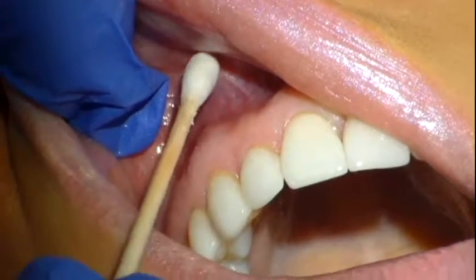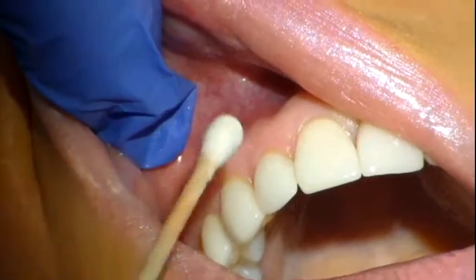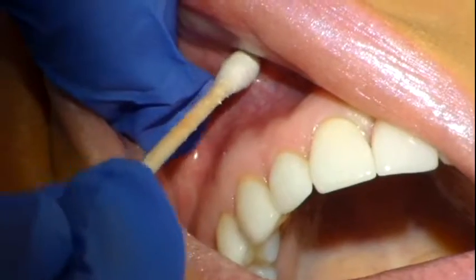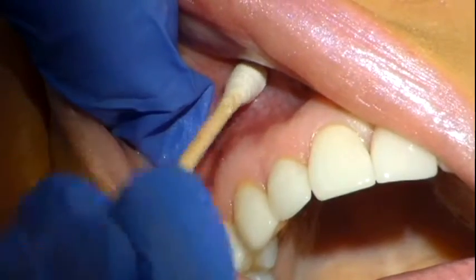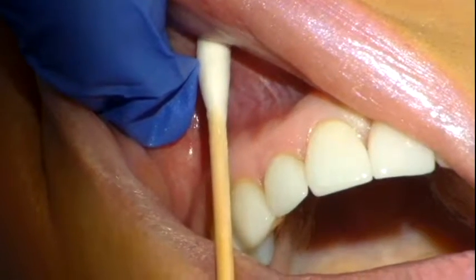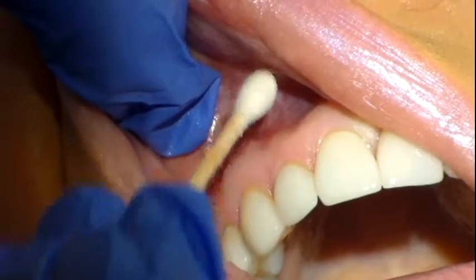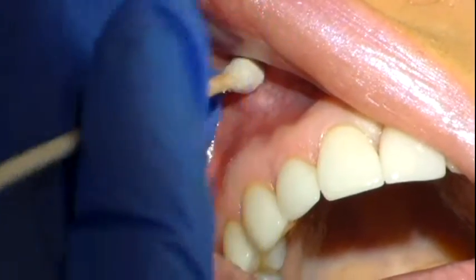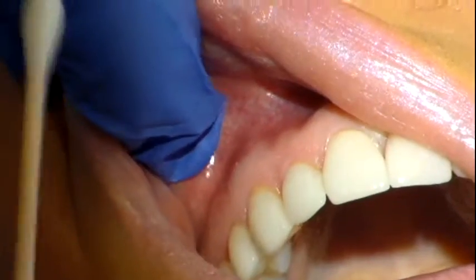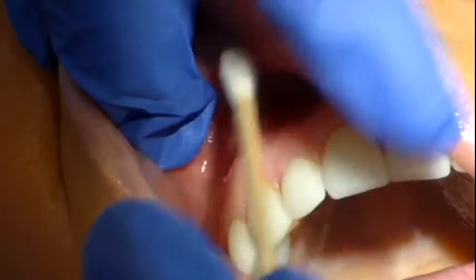You're going to go to the height of the mucobuccal fold and make sure you're parallel to the alveolar slope. Some people have a really steep slope to their alveolar process and you need to match that, because if you don't, you're going to end up coming away from the root and away from the nerve. That can be tricky because you're way out in the air and it feels a little shaky. So you'll see when I do this injection that I give myself a fulcrum to help stay steady.